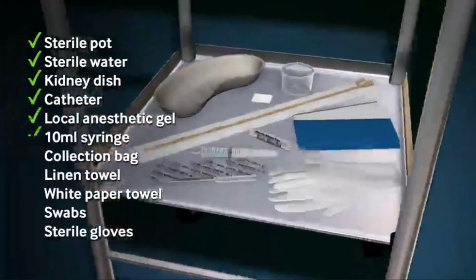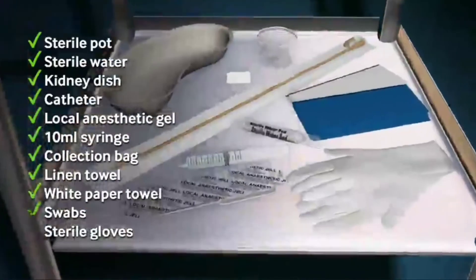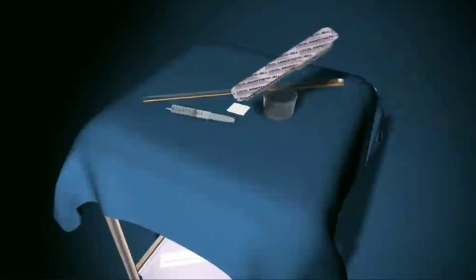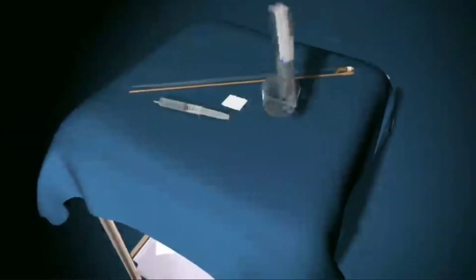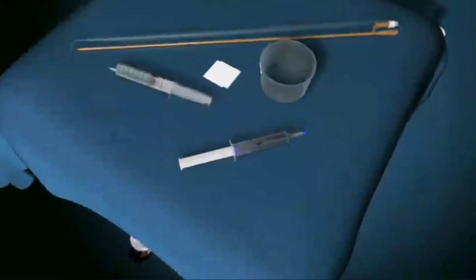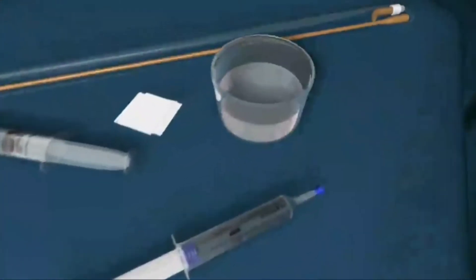Place the items on the lower shelf of a trolley which has been cleaned with disinfectant. Standing at the patient's right-hand side, open a sterile towel and carefully place it on the top of the trolley, avoiding touching the upper surface of the towel. Open the packs containing the other equipment and carefully drop the sterile contents onto the trolley. Put some saline into the sterile pot.